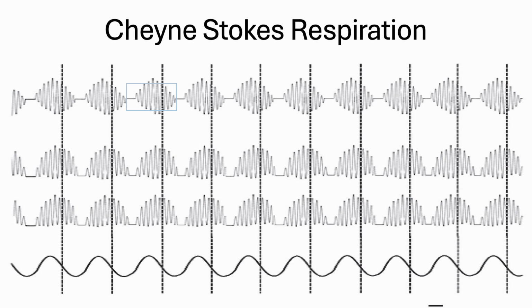And guess what? That's it for now. But those are the very basics of staging and scoring sleep. And as far as the basics go, that's really all there is to it. It's just more about recognizing these patterns in real time when you're looking at a study as it goes by. All right, we're going to hammer this stuff into your brain because all these numbers and qualifying requirements, you've got to know it in your head, and you've got to recall it right when that exam happens. All right, so we'll talk more about all this stuff later.